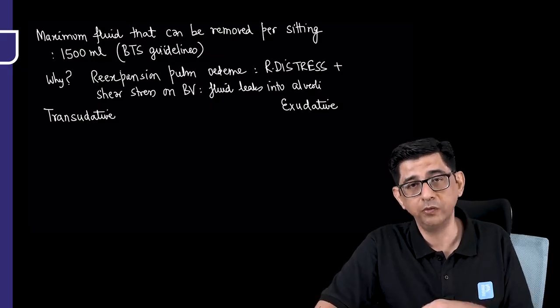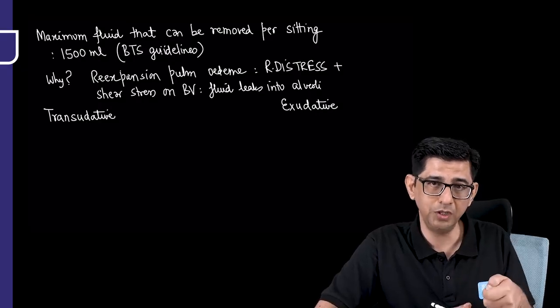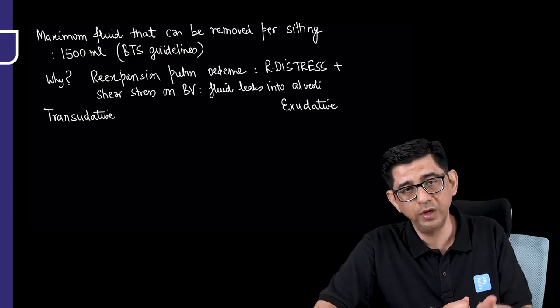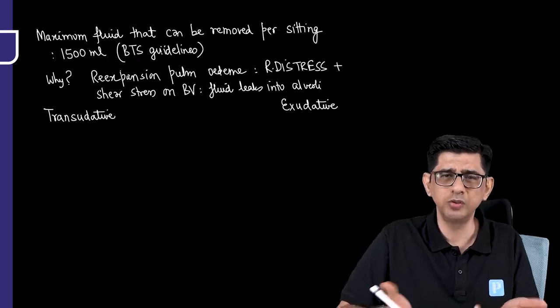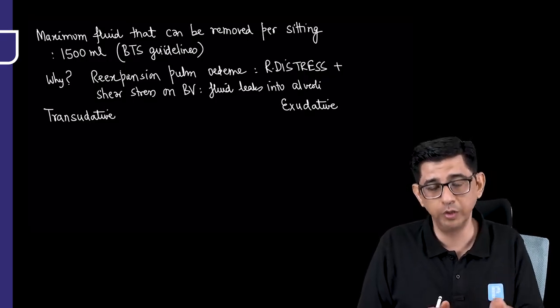When injecting local anesthesia, don't just inject. First try to keep the plunger in a negative suction mode initially when you are going inside, and then you inject. I mean, normally also when you give local anesthesia, you apply a bit of negative pressure on the plunger when the needle is going inside.